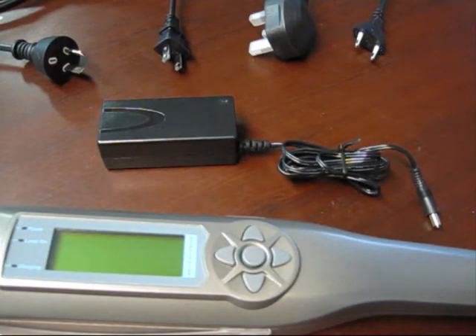Welcome to the first Dermaray UV demonstration video. In this video we shall demonstrate how to connect the Dermaray ultraviolet lamp to mains power in order to charge the internal batteries ready for the first use.